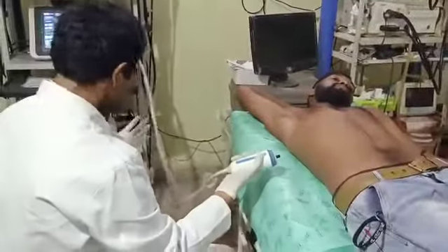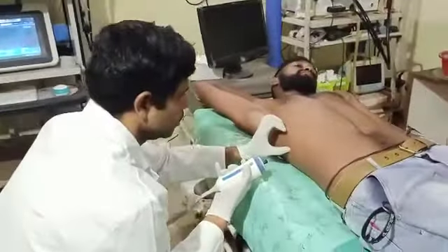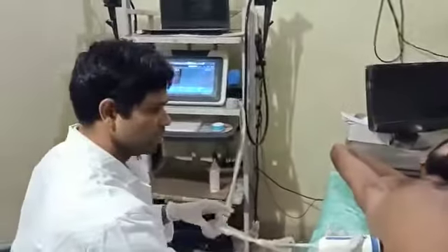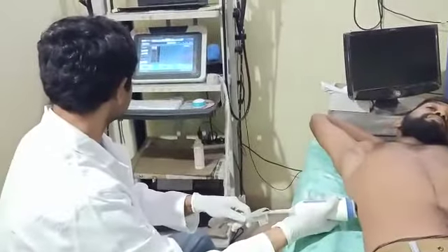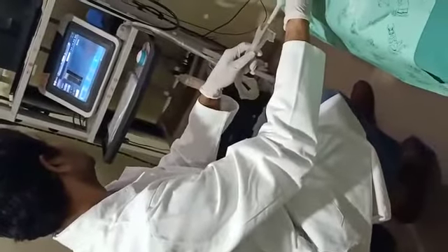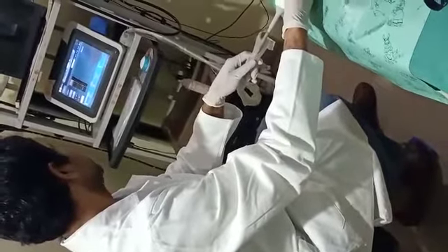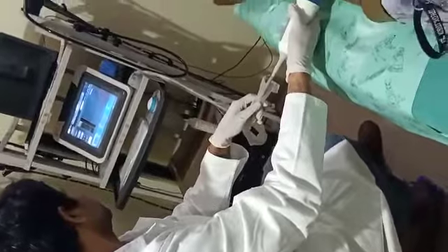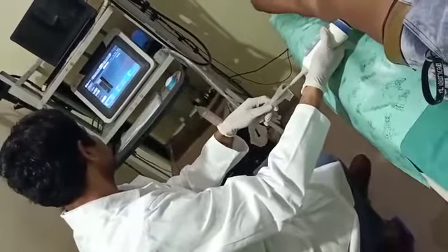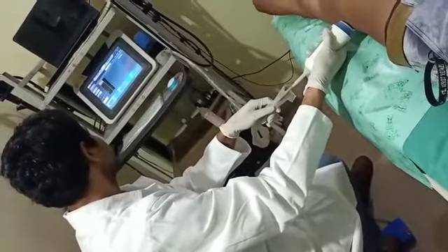With the right hand, you select a good spot and fix it — resting your hand on the couch so it doesn't move — and adjust the direction with the other hand. With the foot switch you take the readings. On the screen, if it is too light the color is pink, if it is too dark it is red. Green color indicates optimal pressure.